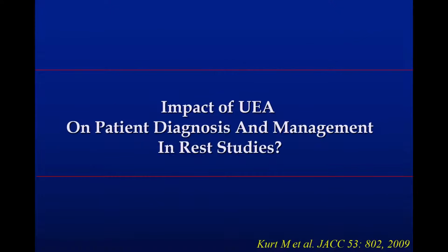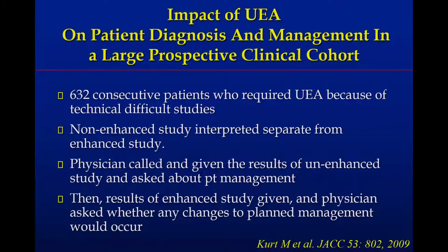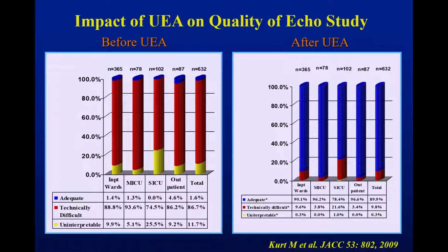What's the impact on diagnosis and management? This is from Dr. Kurt, who's now practicing, I think, in Turkey. I have not seen him for some time, and he did that when he was visiting. This is a great study that he did. More than 600 patients were looking at the impact of clinical decision making and management in such patients.